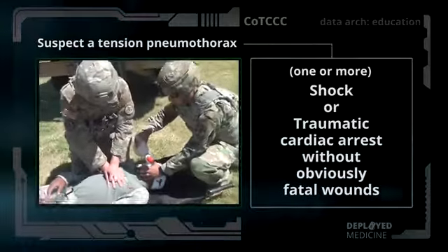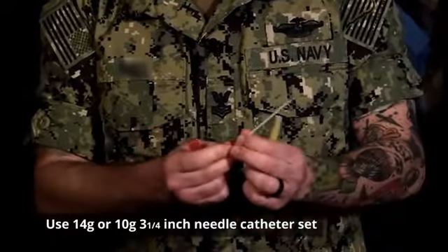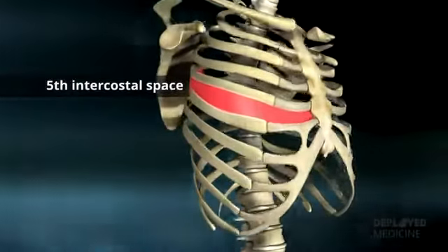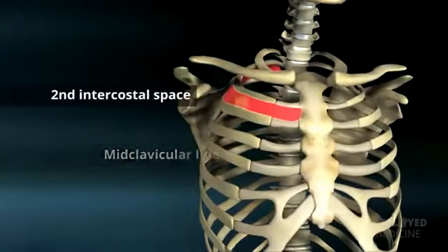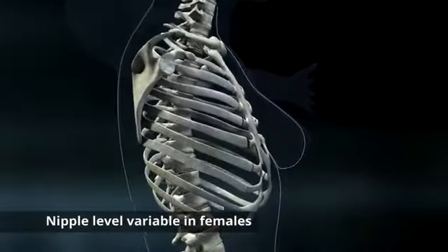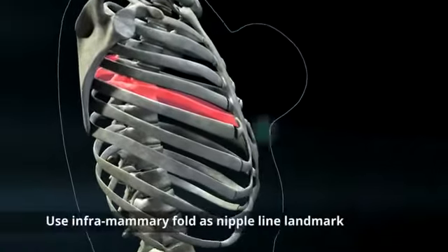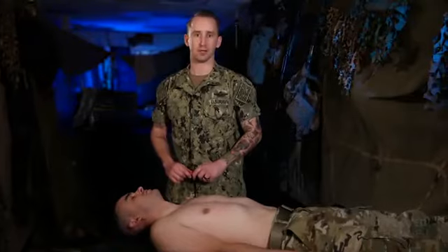without obviously fatal wounds. The needle chest decompression is performed using a 14 or 10 gauge 3¼ inch needle catheter. There are two acceptable sites for the needle chest decompression: the 5th intercostal space on the anterior axillary line or the 2nd intercostal space at the midclavicular line. The nipple level is variable in females, but you can lift the breast and use the level of the inframammary fold. I'm going to demonstrate on the 2nd intercostal space midclavicular line.